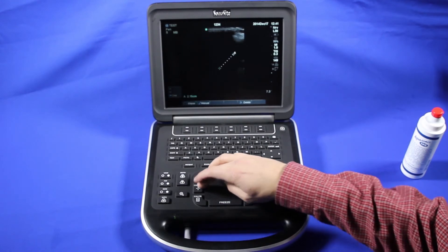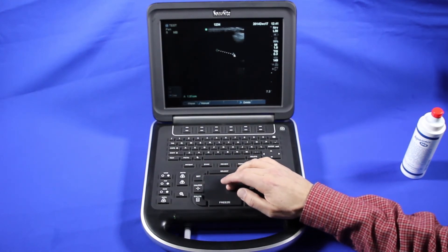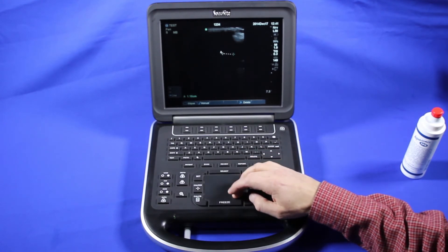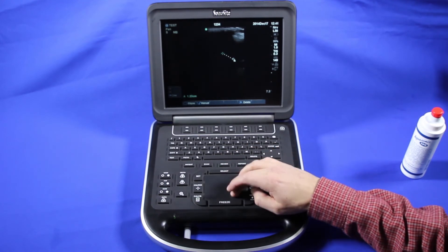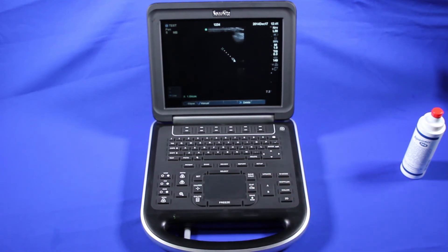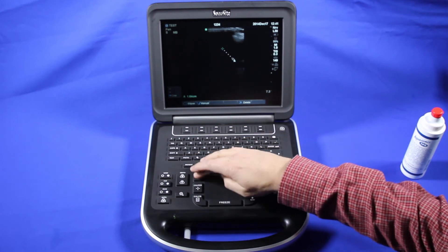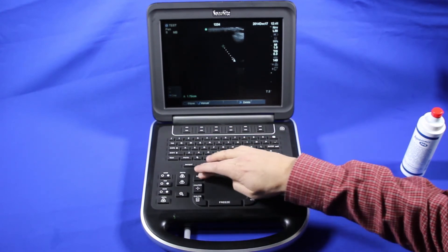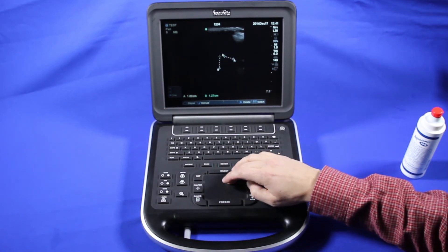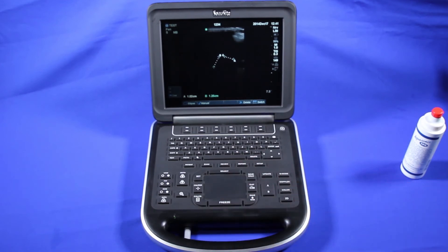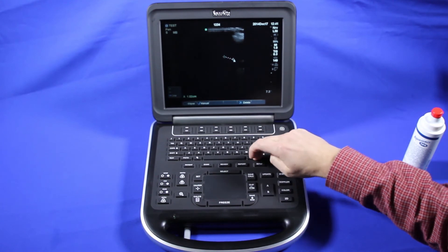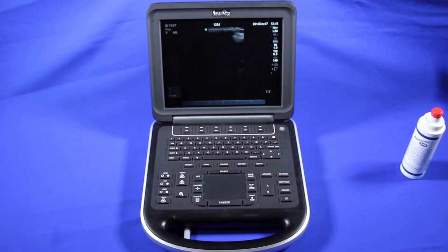To make measurements — just a standard distance measurement for something we don't want to save to the report — we hit select to change the caliper and make the measurement. If that's the measurement we want, we hit save and that will save the screen. This is not saved to report, so there's nothing to do to save the actual caliper. If you hit set to try and end it, it's just going to keep allowing you to move. To choose another caliper, hit caliper again and select to change. To delete, hit the delete key and you're back to regular measurements.